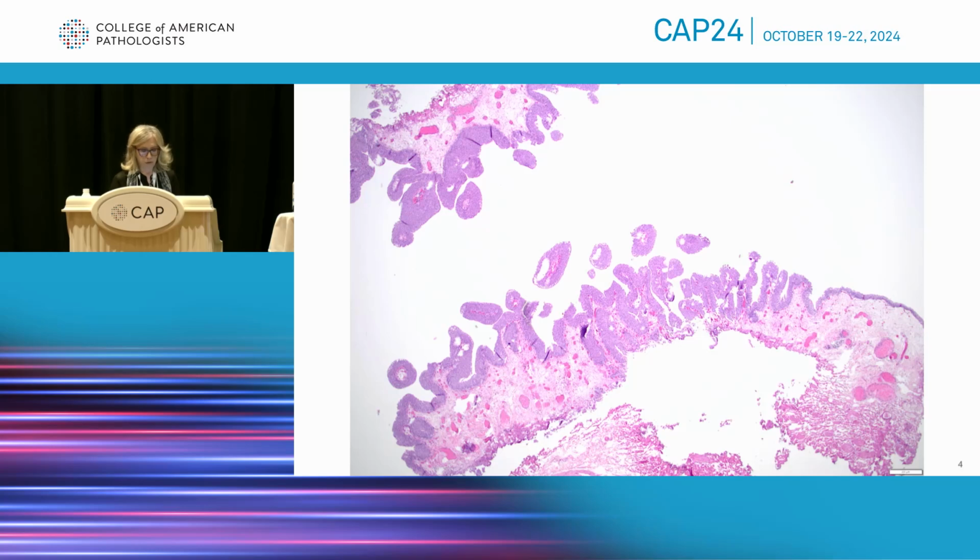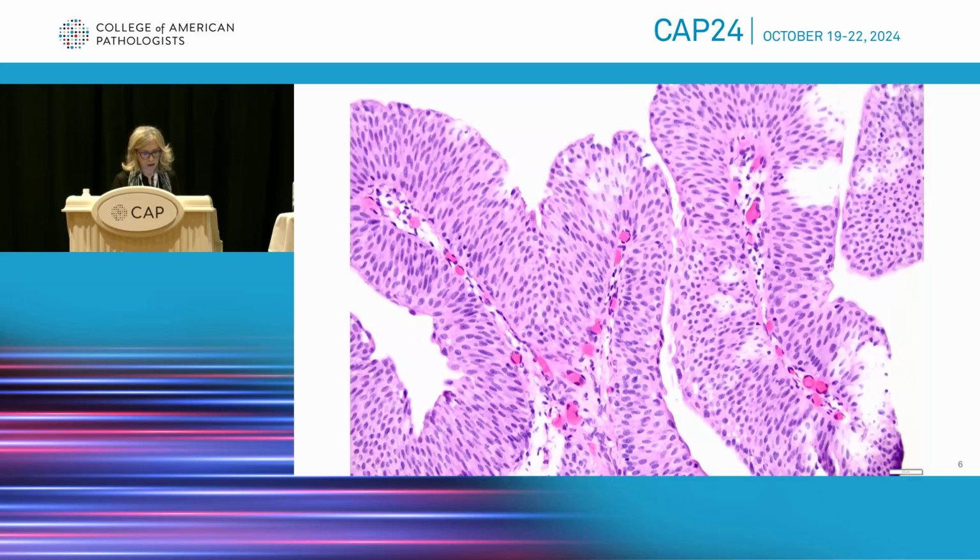Many of these pieces show this papillary proliferation that we could not really diagnose other than papillary urothelial carcinoma. It seemed that there was limited degree of cytologic atypia, but there was no significant pleomorphism or significant hyperchromasia, no mitosis that I could see. So it looked to me like a classic run-of-the-mill low-grade papillary urothelial carcinoma.